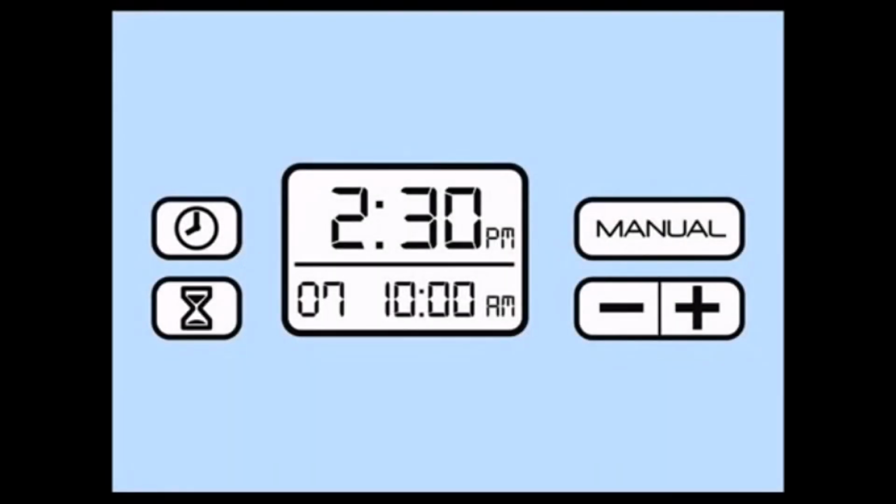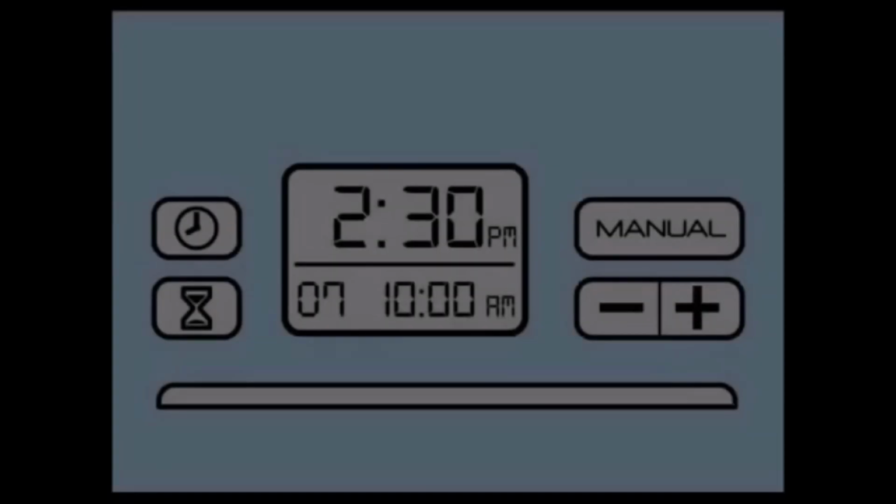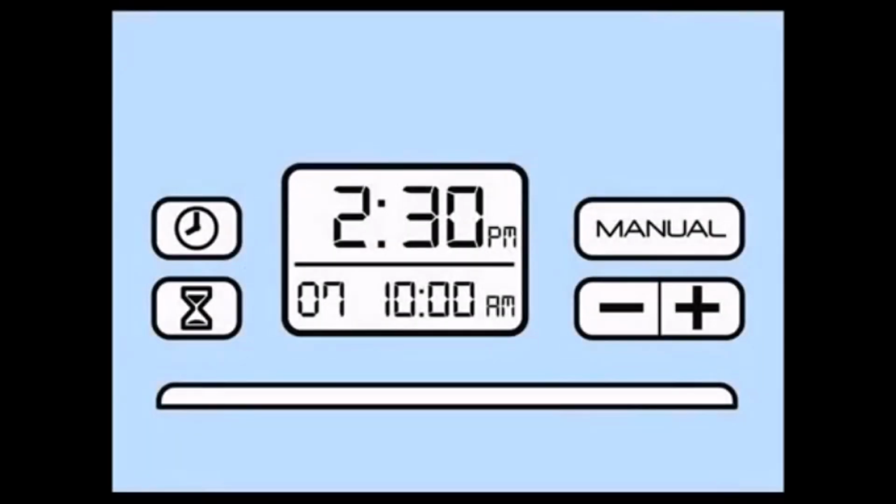When sanitizing, even though the actual runtime may only be 5 to 10 minutes, it's important to let the mask remain in the closed chamber for an additional 2 hours. To assist you in this, there are colored indicator lights positioned below the clock display. Red means the SoClean is operating. Yellow means the cycle is in its 2-hour waiting period. Green means that all sanitizing is complete and your mask can be removed.